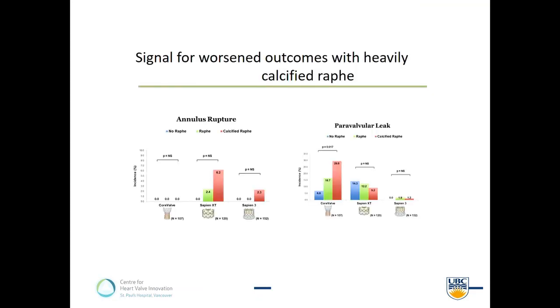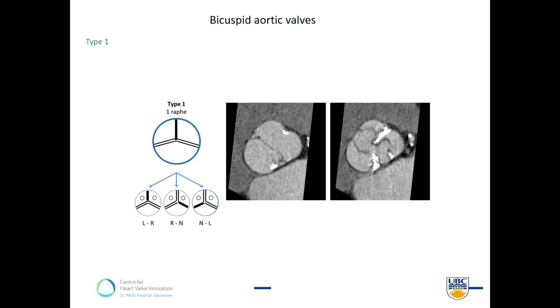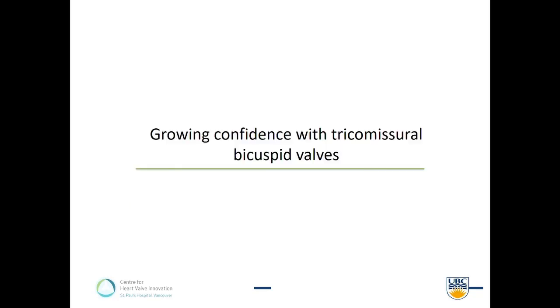So what do we know? We know that patients with Sievers type 1, heavily calcified raphe, are poor candidates for TAVR. They experience more leak, they experience annular rupture depending on the device. This is an example from the intermediate risk trial before they instituted core lab support. The patient was diagnosed at the site with a type 1 heavily calcified bicuspid. They decided to ignore it and underwent TAVR, and they perforated the sinus of Valsalva. This is hostile root anatomy, as we heard from Dr. Waxman earlier.